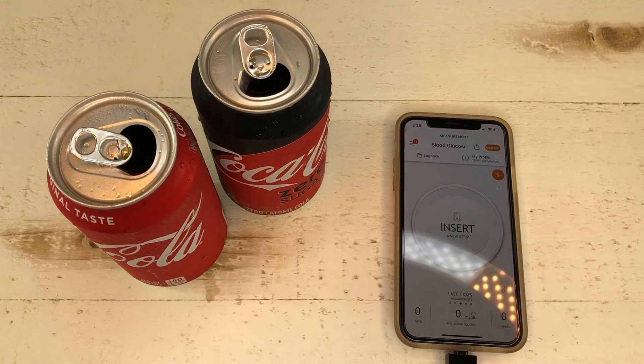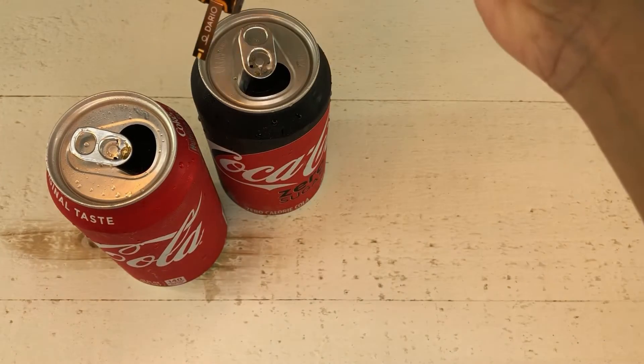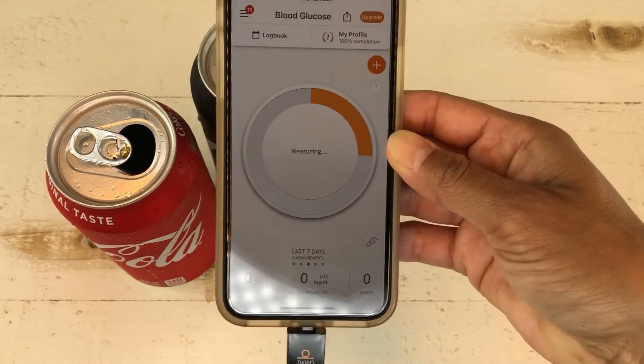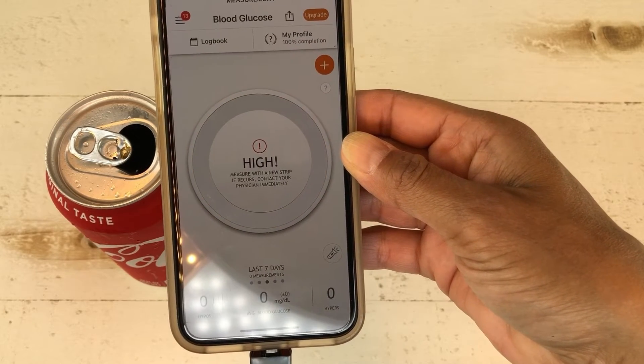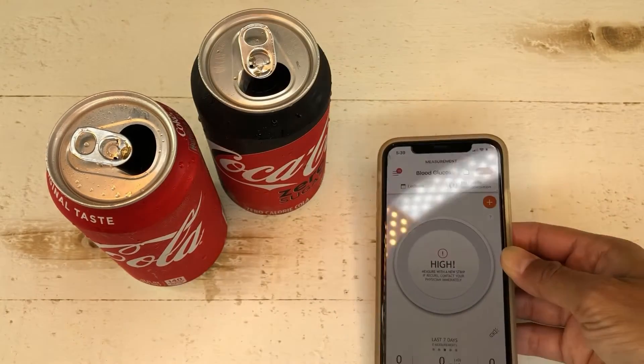I take out the test strip and put in a new one. It says 'place blood drop,' I put it into the regular Coke, and it's doing the analysis. It's fast - HIGH! So it works with the Dario meter as well. That is awesome to know.